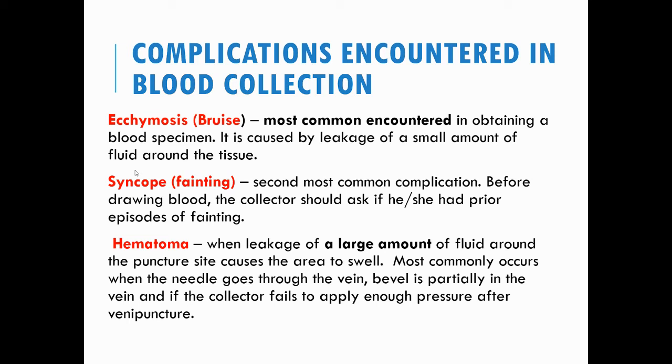You should first ask the patient if they have any history of fainting, so you know beforehand that there is a chance they could faint. Third is hematoma, leakage of a large amount of fluid around the puncture site.